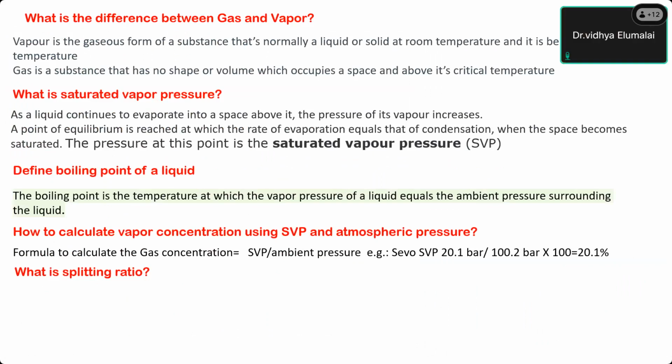So it is the percentage of fresh gas flow to enter the bypass. Ratio of the fresh gas flow passing through the vaporizing chamber to the fresh gas flow passing through the bypass chamber, sir. It is not called variable chamber, it is called vaporizing chamber.